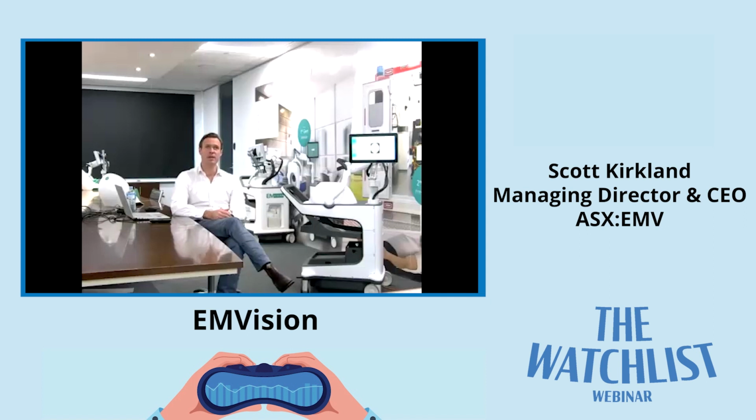From a regulatory perspective, it also becomes a predicate device. So we're going down the de novo pathway with the FDA at the moment. So this is for low to moderate risk devices, class 2. Class 2s like ultrasound, for example. And we're proving safety and performance from first principles. And once we have that proved out, our follow-on products like our Gen 2, there's an opportunity there for them to pursue the 510K pathway, which is an expedited pathway to market.